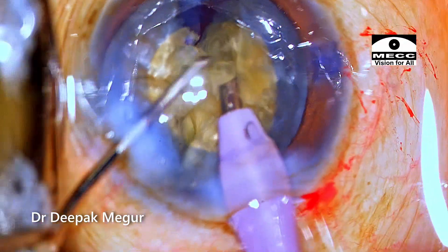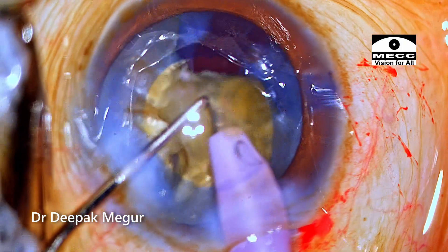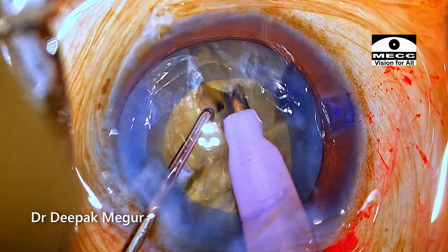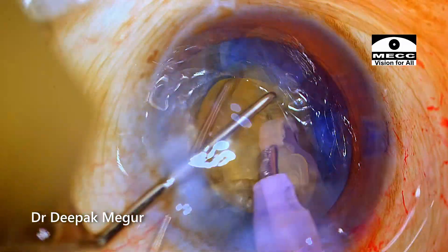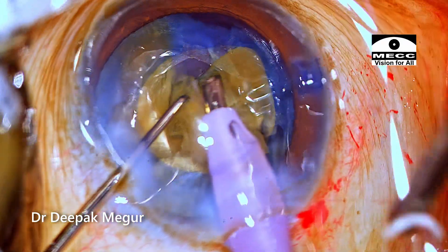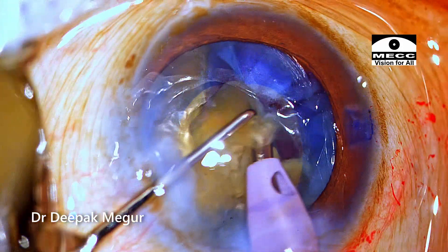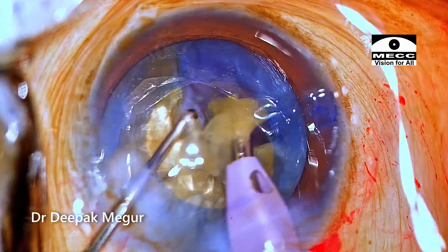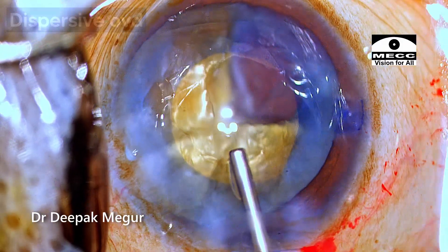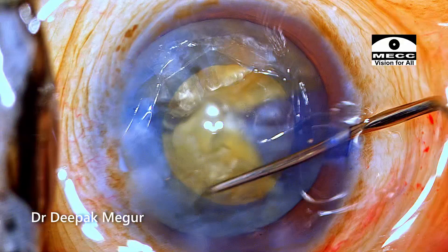All the fragments are already created. Time to emulsify each of them — they are grasped with the phaco tip and mobilized anteriorly at the level of the rhexis margin, then emulsified in a controlled manner. Lens chatter and turbulence is controlled by using power judiciously via the foot pedal. Going a little slower controls things better, minimizing turbulence and lens chatter, which in turn minimizes endothelial trauma. Since this is a dense nucleus, I replenish the anterior chamber with OVD — dispersive OVD goes in first just beneath the endothelium, then HPMC goes into the bag.